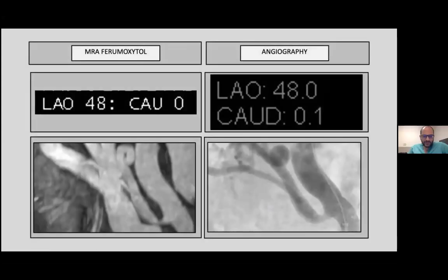And then Amr is asking to elaborate on the previous slide, the one with the contrast MRI. Are you asking how he got the table positioning? Yes. So when you did your 3D reconstruction, it gives you these LAO and so on? That's correct. We use TerraRecon, but other vendors have similar things where, when you do a multiplanar reformatted image, it will give you the table positioning that would allow that particular vessel to be viewed.